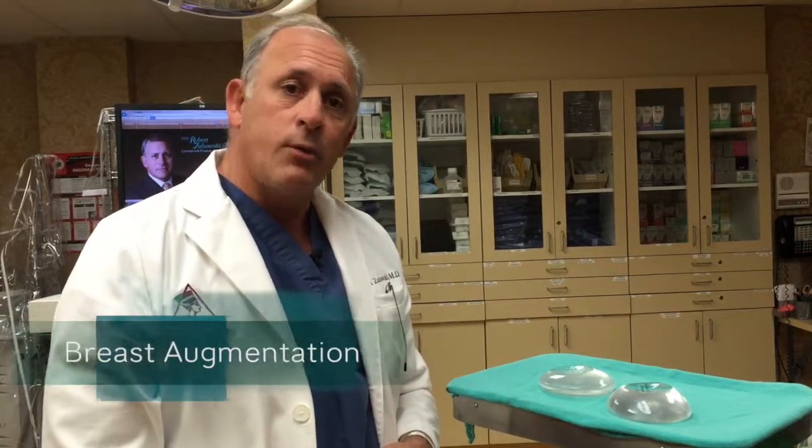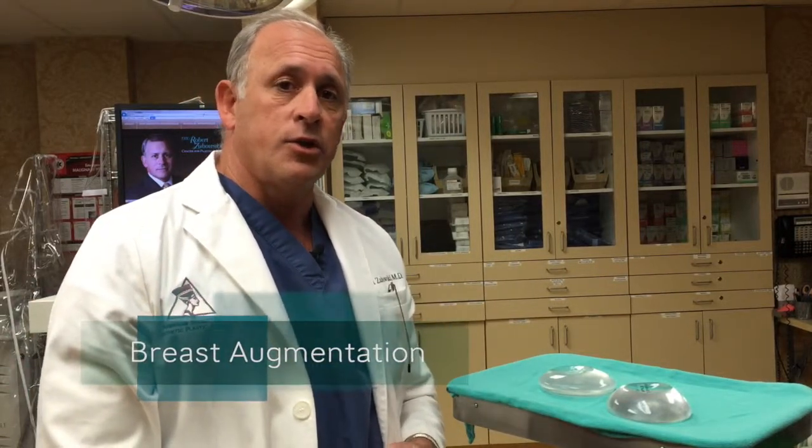Hello. Today we're talking about breast augmentation, which is one of the most commonly performed plastic surgical procedures in the United States with an extremely high satisfaction rate. There are, however, certain considerations one has to be aware of before undergoing the procedure. The first is implant selection. Do you want silicone or saline implants?